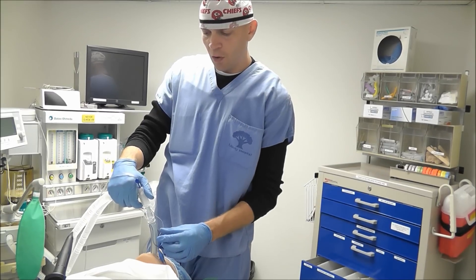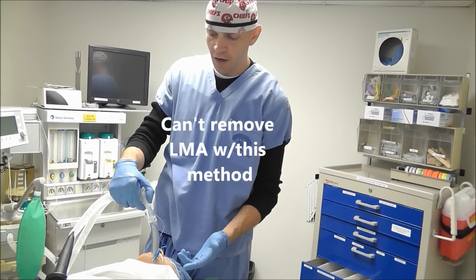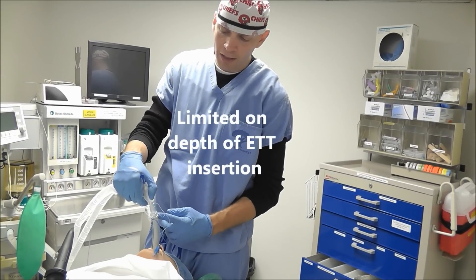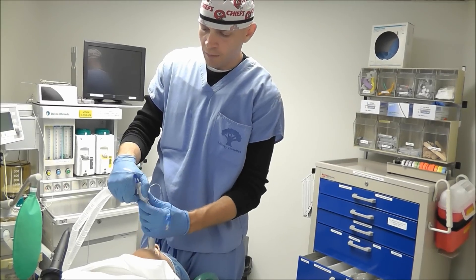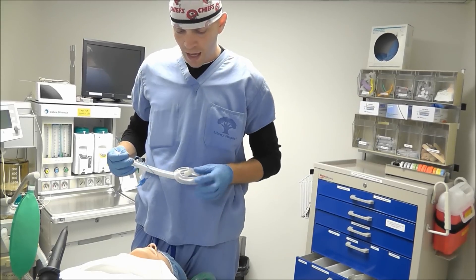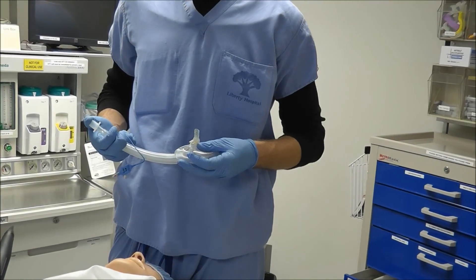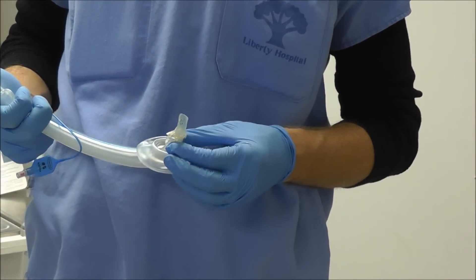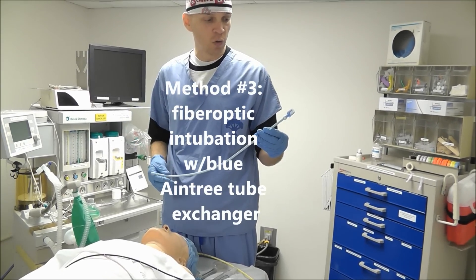The second problem with this technique is that I cannot remove the LMA without extubating the patient. Because of that, I'm limited on how deep I can insert the endotracheal tube. I'm going to take this out so you can see this demonstrated — that is the max amount of length that this endotracheal tube extends beyond the LMA. I'm not going to be able to insert it any deeper than that, and that can be a big problem if someone has a deep larynx.